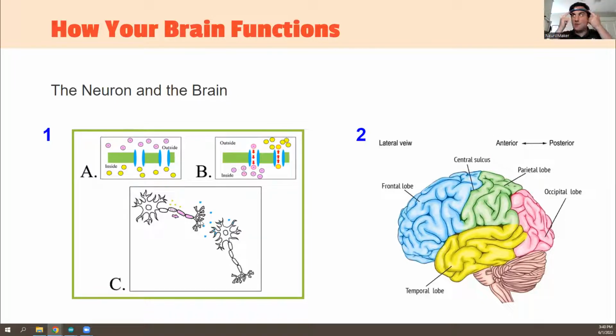You can see this headband here. What it can do is detect those really, really small electrical signals, what you would call voltage differentials, on your scalp. Right here on the inside of this headband, there are these small electrodes and they can pick up all these small electrical pieces. And the way that this works, once again, this is a crash course. If you want to learn more, we have lots of curriculum that we can teach you through. I spend a lot of time doing that.